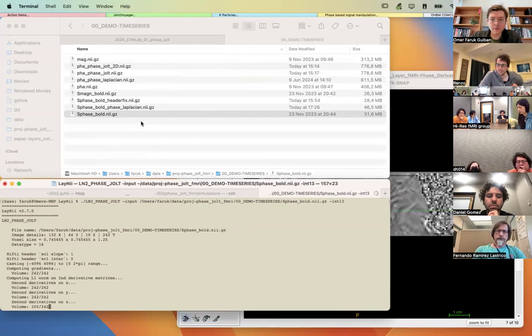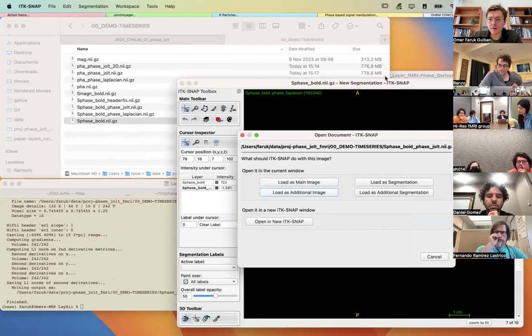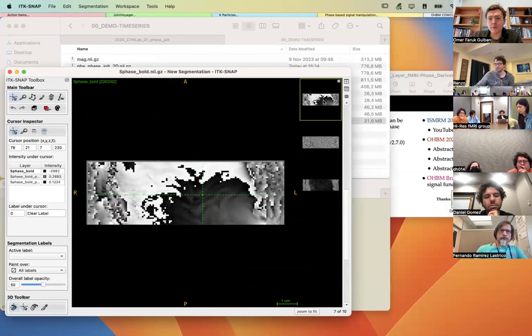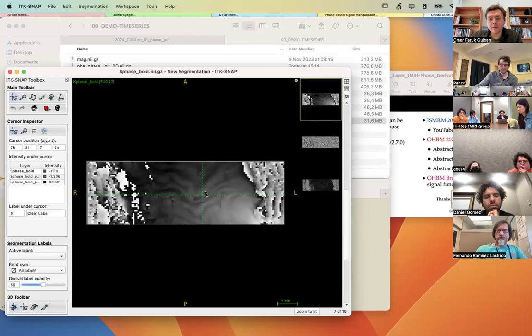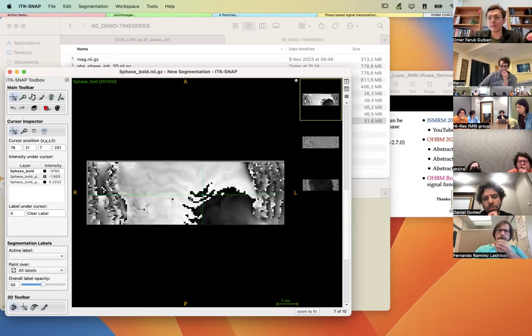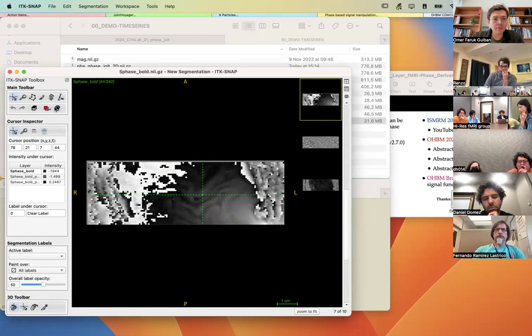Faruk, I'm curious, does it surprise you that the phase inside the brain, the phase jolt, is so constant and consistent? Not at all. It doesn't surprise me at all, because look here. Inside of the brain, the phase changes at a low spatial frequency. It changes mildly over space. Maybe I can stop the time series.